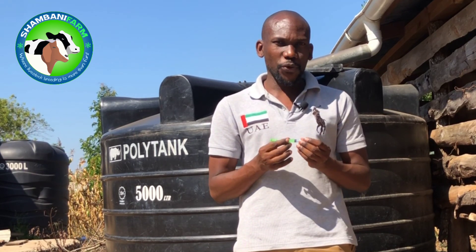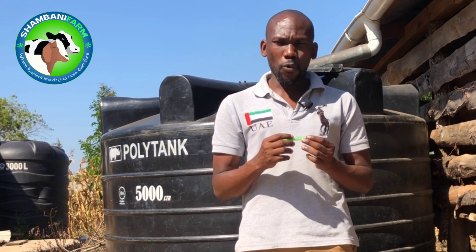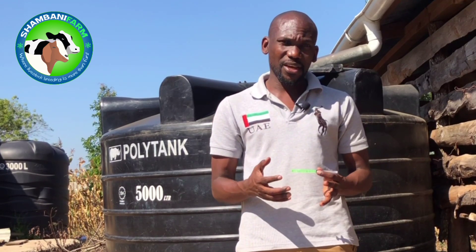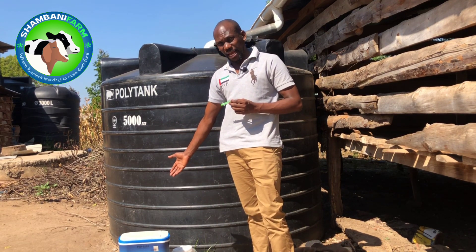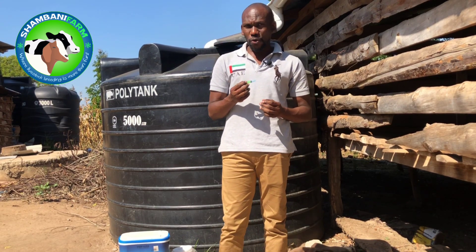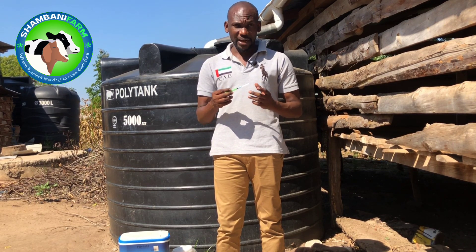I'm also going to show you how to withdraw the medicine from the medicine container. Today we are administering a vaccine for CCPP, and I don't want to withdraw it until the animal is ready, because this vaccine must be stored in a cold environment. We have it stored in a cold container with ice cubes to preserve the coldness.